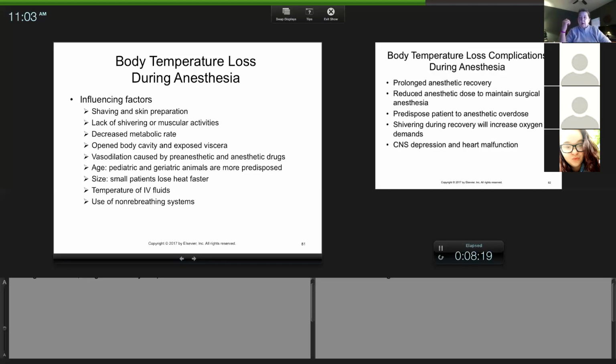And I took them off. Luckily, I didn't hook them up to the patient. And we checked the incubator, and somebody had turned it up, and they were way too hot. So again, you don't want them hot to the point that they would burn you.